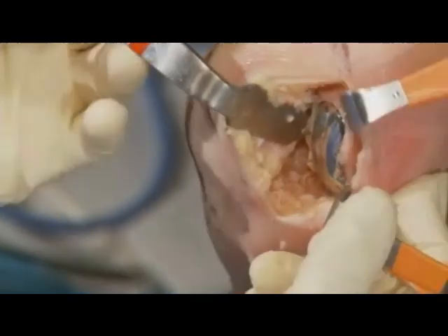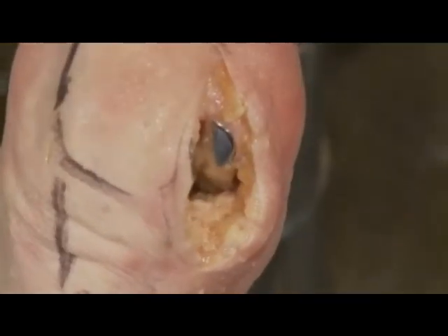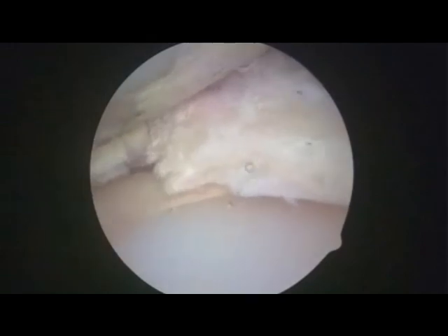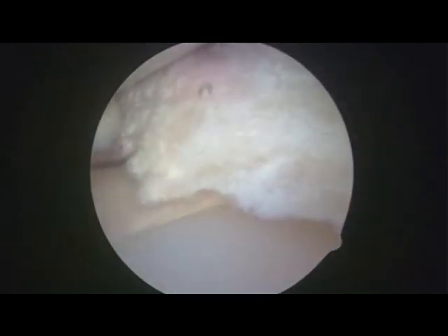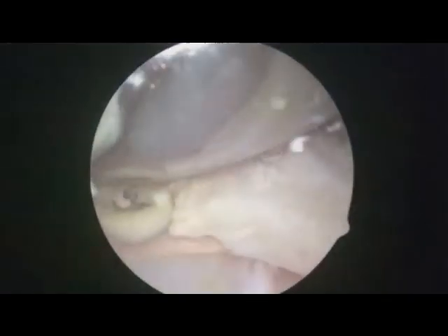So at this point, we take our instruments out. Now at this point, I know that we talked about cementing. This is when I would cement it. Let me just show you arthroscopically what we've got. So here's our final product. Implant now cemented in position, held down, and there's our femoral implant there. And you can see that throughout. Now I would clean all this debris out, obviously, but there you go.